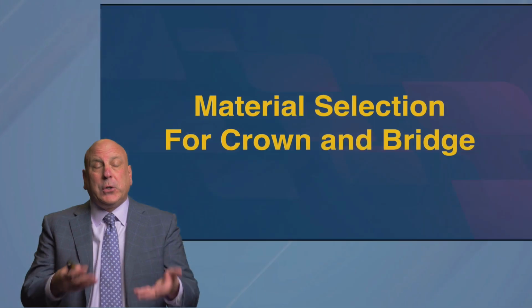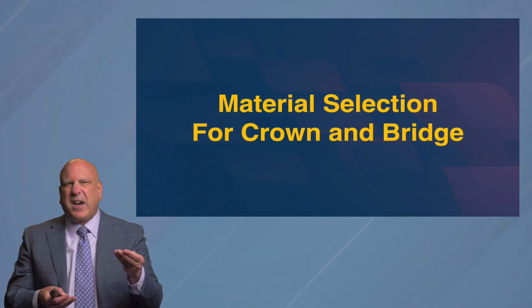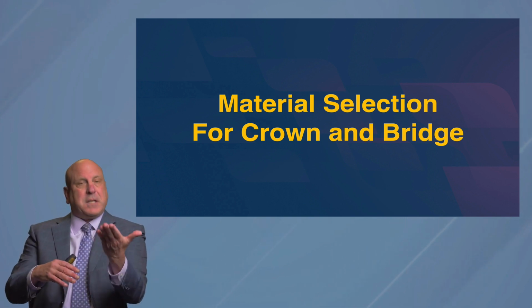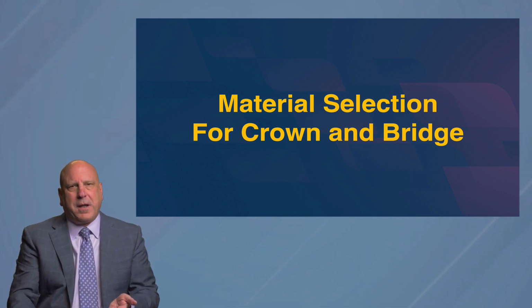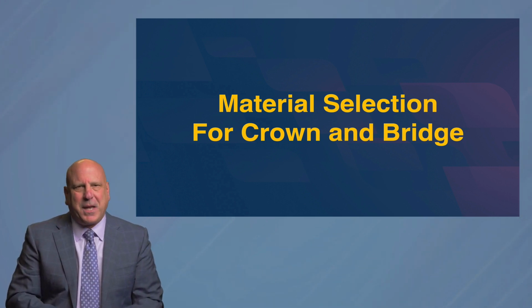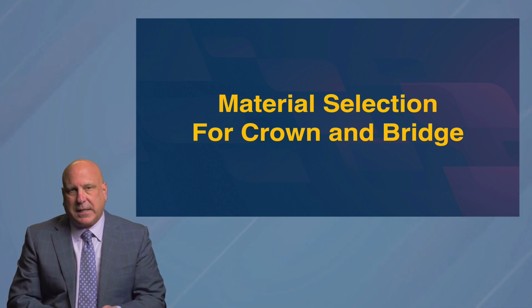I actually got to do 6 veneers in dental school as well, so they really weren't counted as crowns. That was kind of a special project, but I had a very early exposure to doing porcelain veneers. The cements back then were very runny, like the consistency of maple syrup. You put it in the veneer, you had to tilt it the right way or it would all run out, and then you'd have to put more cement in. Feels like a plot by the cement companies, but it's gotten more complicated today in terms of material selection.